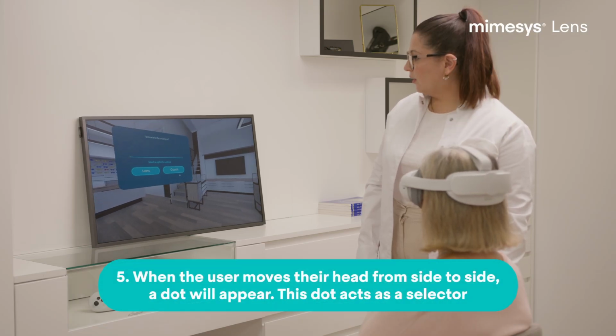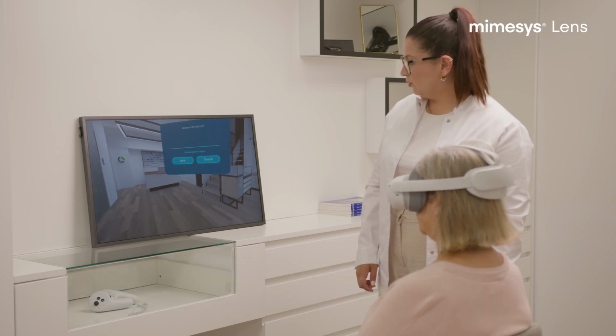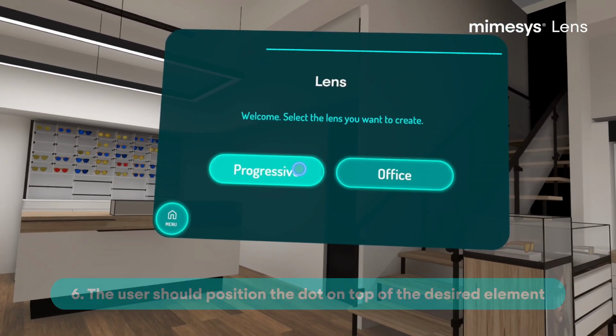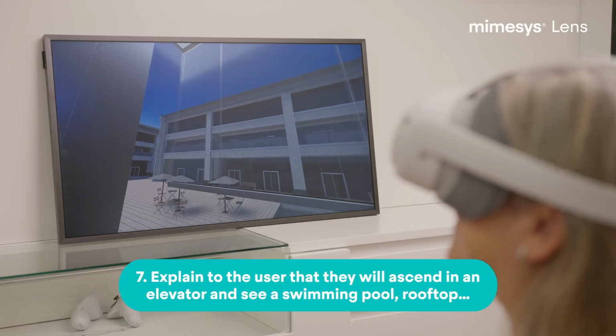Explain to the user that when moving their head from side to side, they will see a point or selector moving. They should indicate what option they want to select. At the start of the exercise, explain to the user that they will ascend in an elevator.